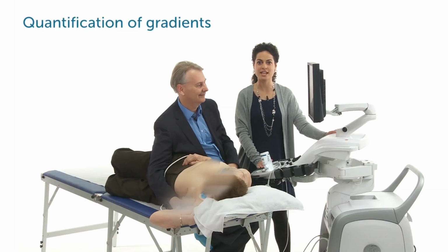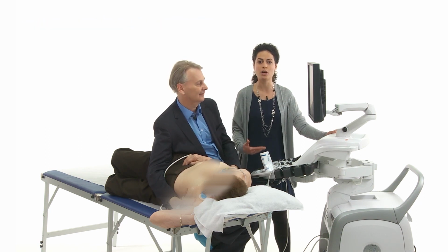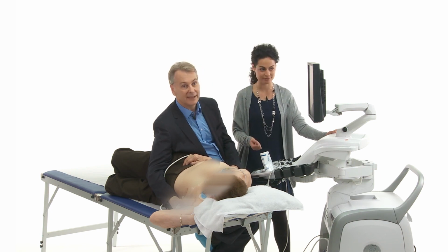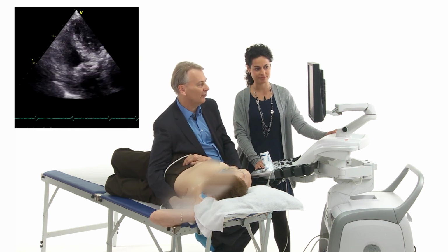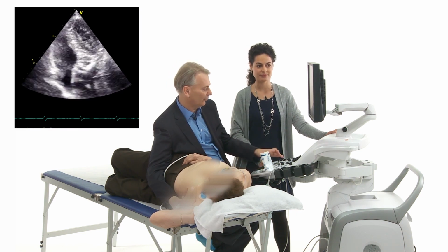But measuring gradients is only one side of the story. It's also important to know how to obtain a very good signal. And this we're going to show you right now. So our patient is 85 years old, has a suspicion of aortic stenosis, but we want to know the degree of the stenosis. So what are the next steps? Right, I would not rely only on the morphology. I would rely more on the continuous wave Doppler that we place through the aortic valve.